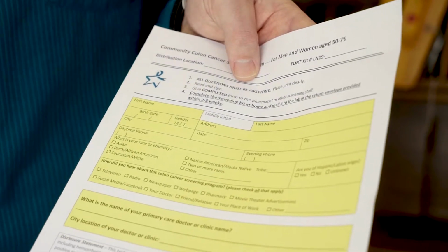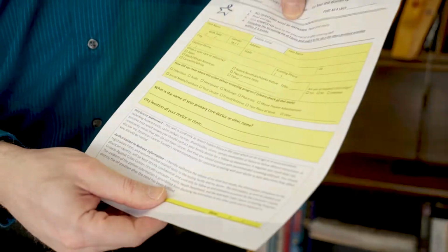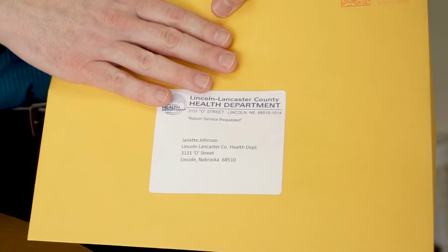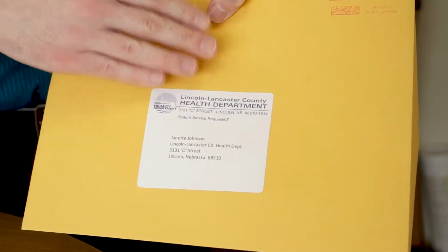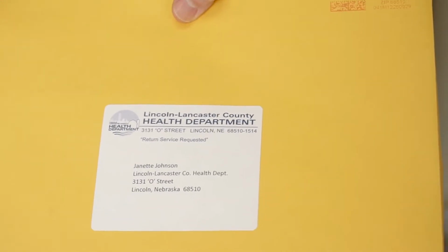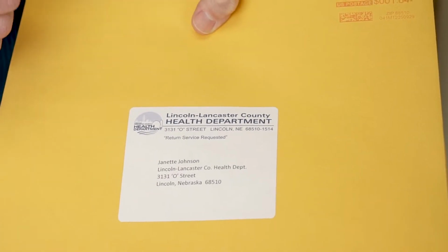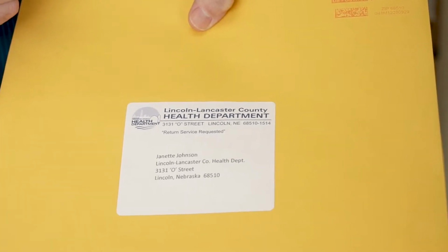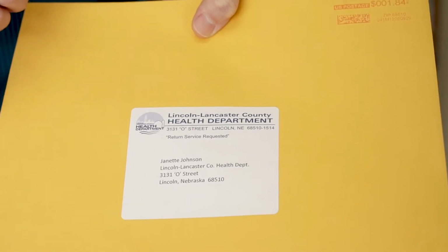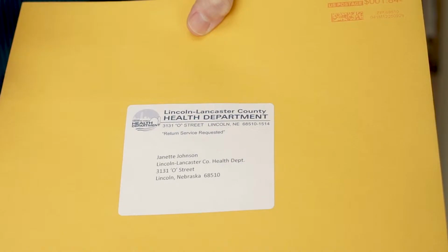Once you've provided them the kit, they have this filled out, and you have the number on there, then you keep this form. You can keep the completed forms in the bag to keep them separate. At the end of each week, you can mail these in. We have a pre-stamped envelope with our address. We might have someone come in and check in and pick them up, but again, just plan on mailing these in, whether you have 2 or 3 or 20. We want you to mail those in so we can enter the information into the database.